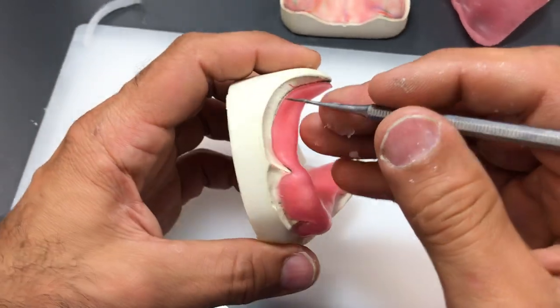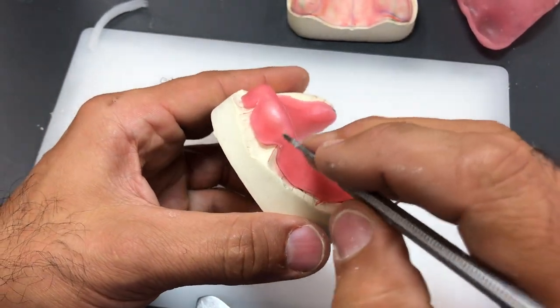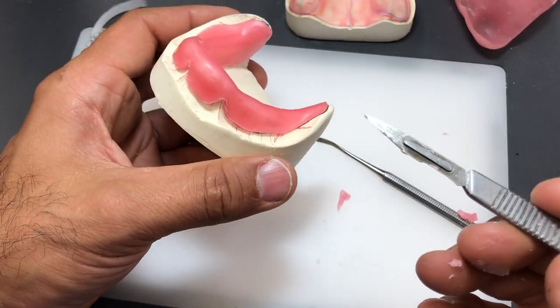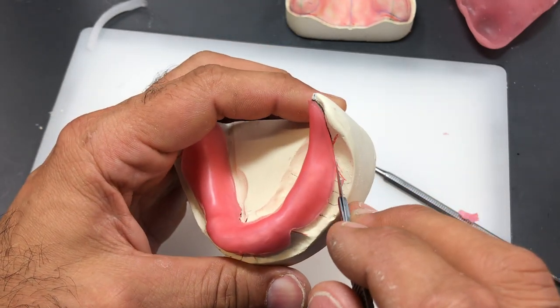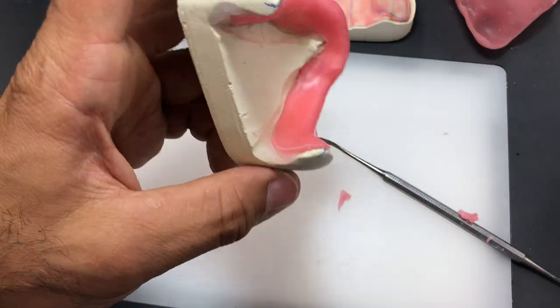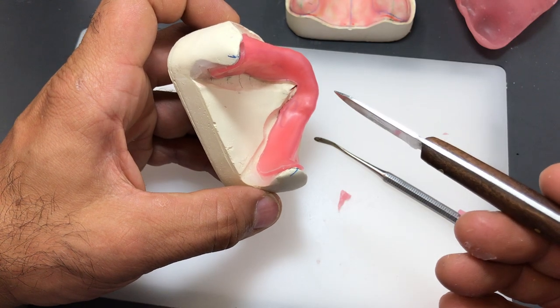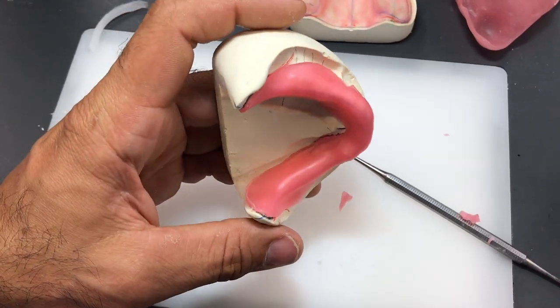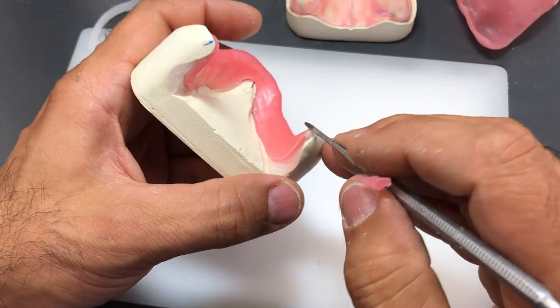Just go back and clean off a little bit of the flash of wax that's caused by the blade. I used a fresh blade, which allowed me to cut through the wax with very little resistance and create a nice sharp ledge. Try to use a fresh blade when you're doing this. Don't use the stock blade, it's just never sharp enough and it's too wide and it's just going to displace your wax away from your lines and it makes it very difficult to create an accurate finish.